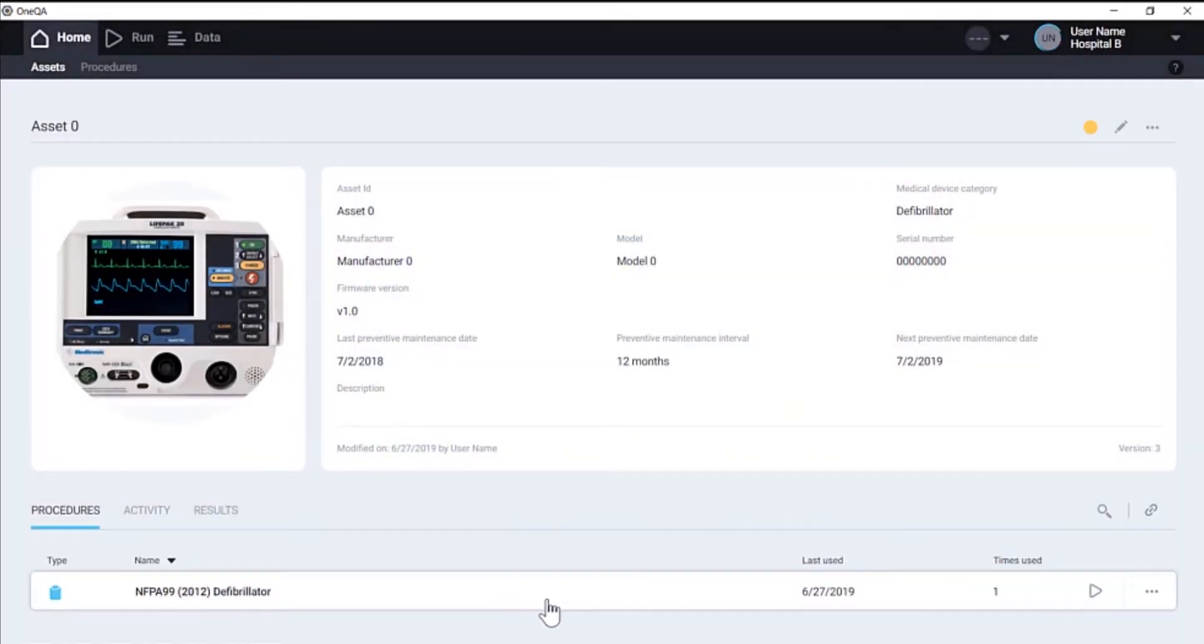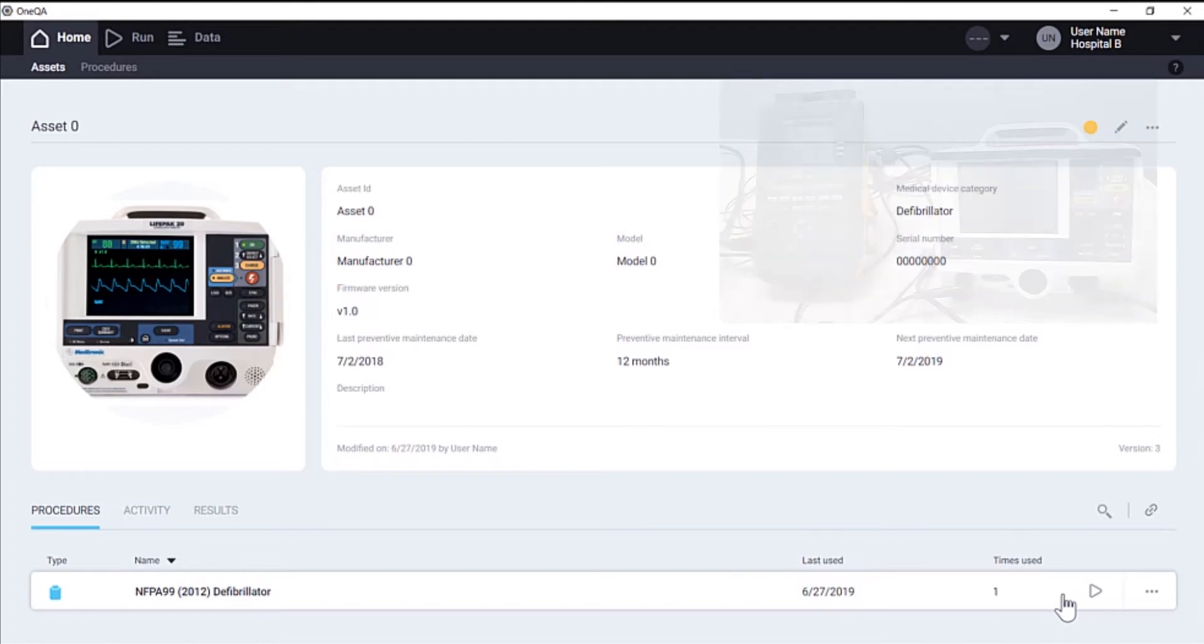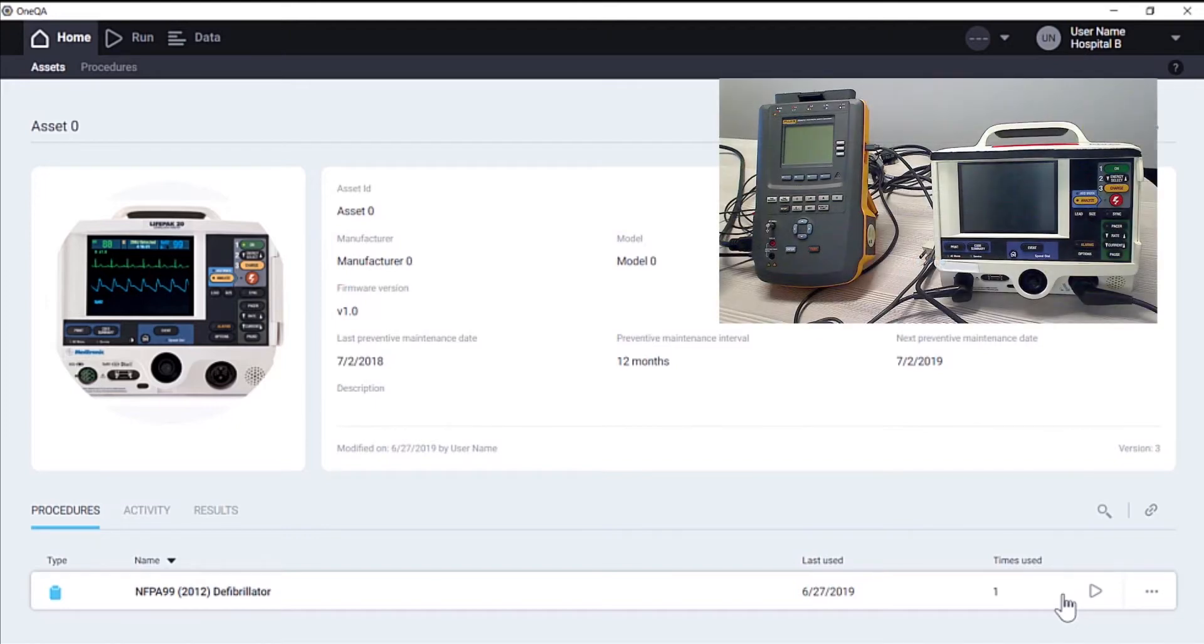Once it's linked, it will show up in this list of procedures associated with the asset. Before running the procedure, we need to connect our test device by plugging it in via USB and turning on the test device.